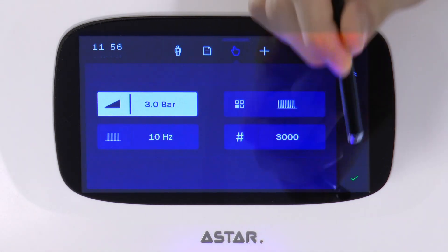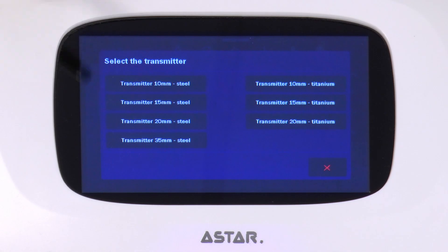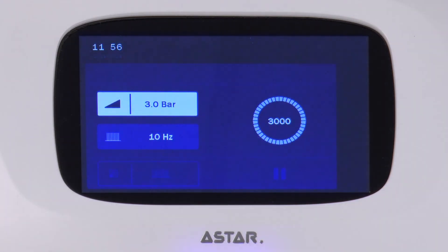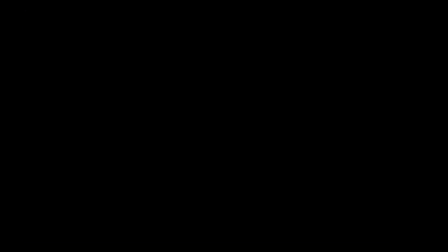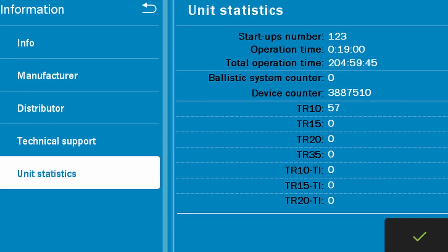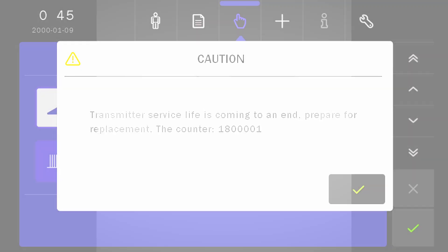Now before starting each treatment, the device will ask which transmitter is installed. Click on the correct option. The counter will keep track of the wear and tear of all transmitters. When a message about approaching 2 million shocks for the transmitter is displayed on the screen, acquire a new transmitter.